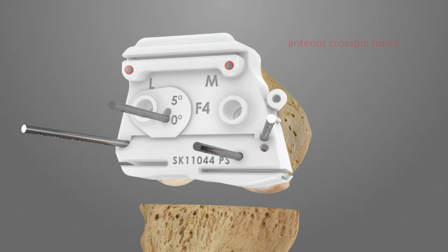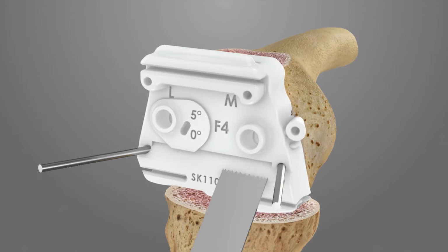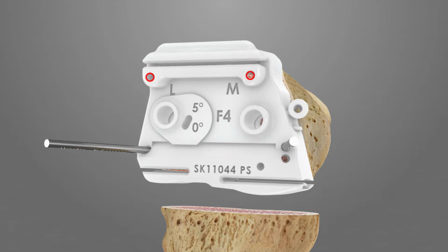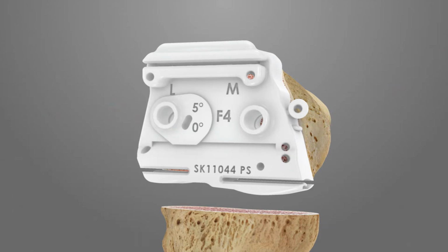Anterior crosspin holes and a medial offset crosspin hole are provided to allow for additional stabilization of the F4 iJig. Remove the initial 2 Steinman pins that were used for rotational placement. Proceed with the posterior and anterior femoral resections, followed by the anterior chamfer femoral resection using the F4 iJig. If either of the anterior crosspin holes were used to stabilize the F4 iJig, remove them before completing the anterior chamfer resection. Next, drill the 2 implant lug holes using the 8 mm femoral drill bit. Remove the crosspins and the F4 iJig.